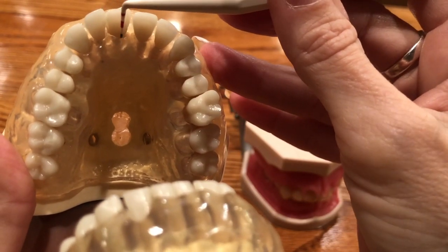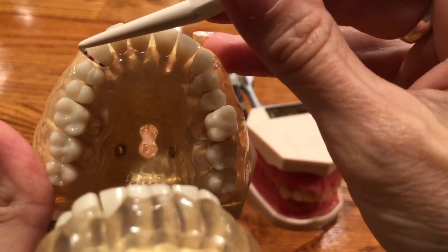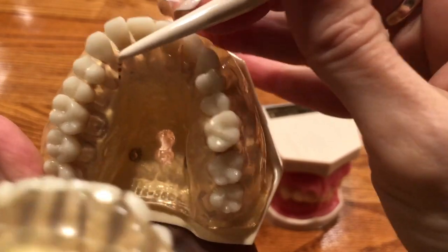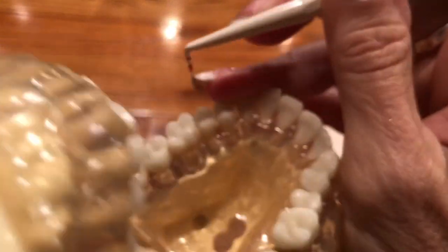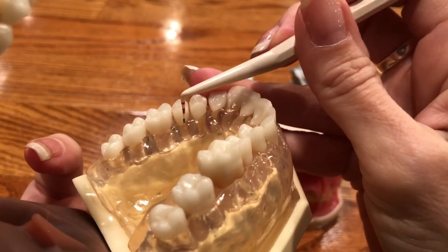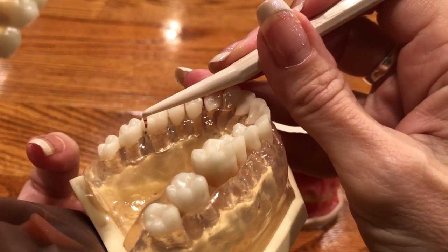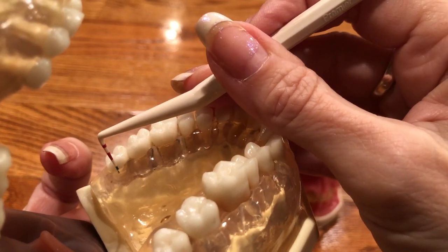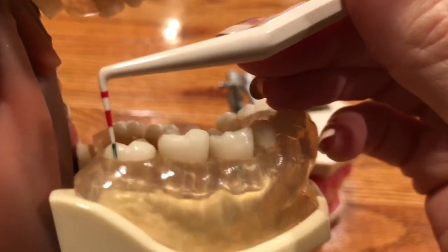Not too many people said 1, 1, 1 up there. 2, 2, 2, 2, 2, 3, 2, 2, 3, and we measure a little bit more in between here, but I'm just kind of showing you for the video. 3, 2, 3, and obviously you can't tip upside down like this, but it would be very nice for us if you could. 2, 1, 2, we have to lean over, so the further you can tip your head back, the easier for us. 3, 2, 3, 3, 3, 3, we lean over all day long. Sometimes I can't even stand up by the end of the day. 3, 2, 3. Then we move to the bottom and we do the same thing on the bottom teeth.